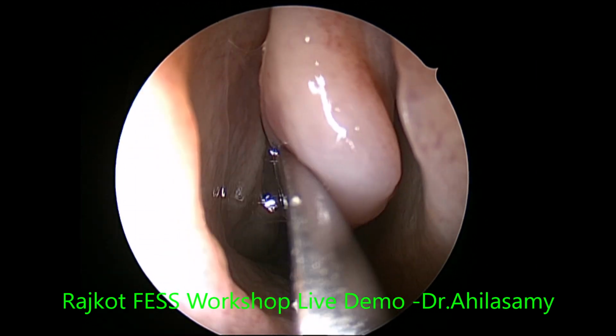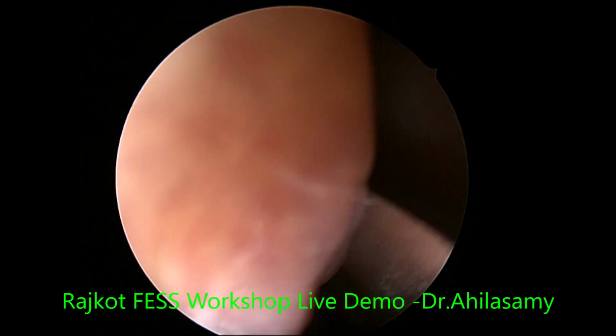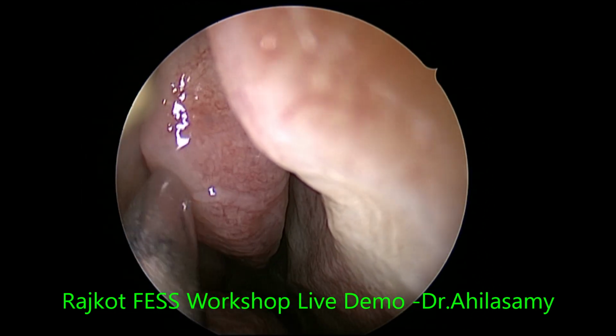That's the middle meatus. Inspection of the middle meatus to rule out any pathology there. Now I am looking at the sphenoethmoidal recess.